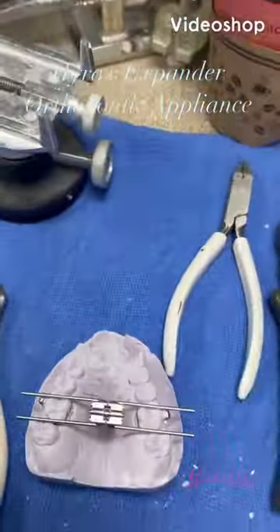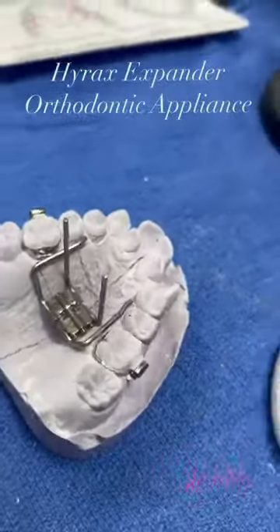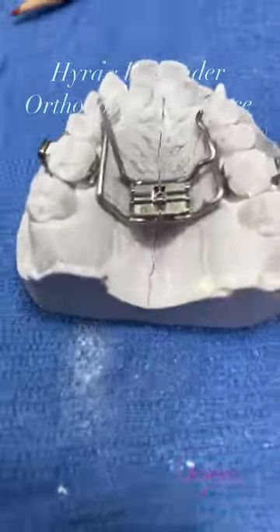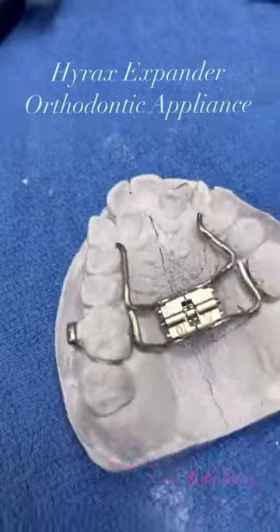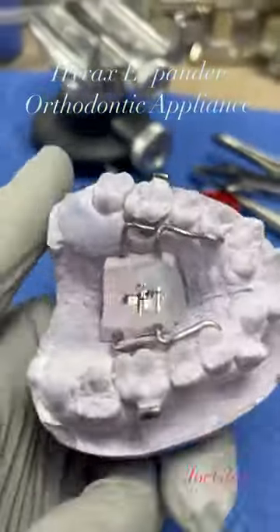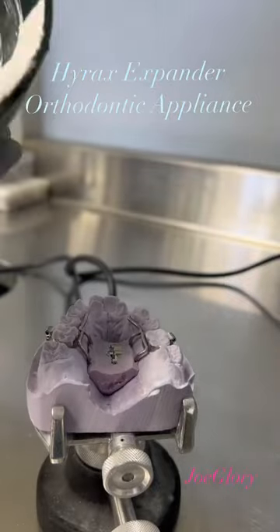Hey, good morning everyone, this is Joe. I'm trying to make a Hyrax — a Hyrax is just to make space for a narrow maxilla. I'm putting it together by stages.